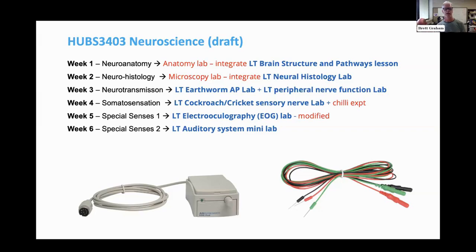In this case, what was great to see was the EOG lab, which is really the electrooculography. And you might think, well, what does that have to do with balance at all? But if I tell you that there's an intimate relationship between our balance and our eye movements, then you'll begin to understand why I got very excited about the EOG labs. It's a very easy setup. You just need 3 electrodes, and the pod, which is actually the image there. Yeah, so that's the EOG pod.